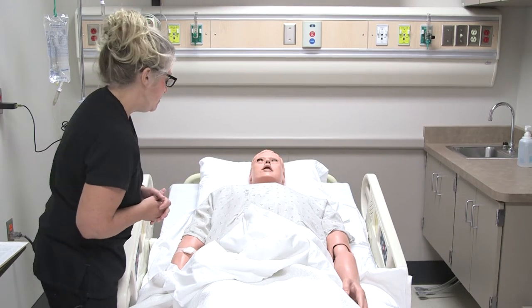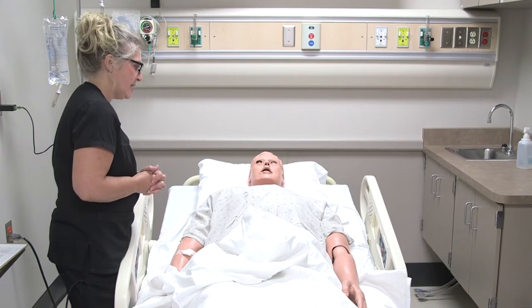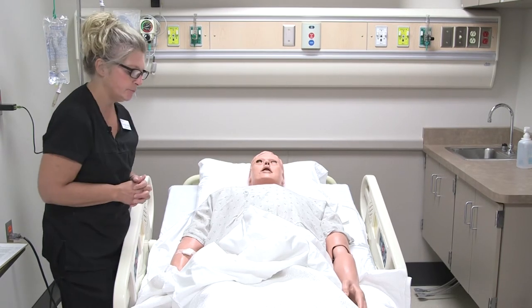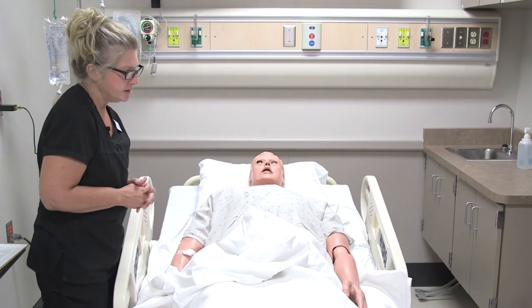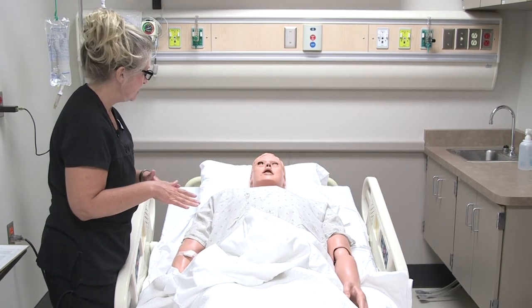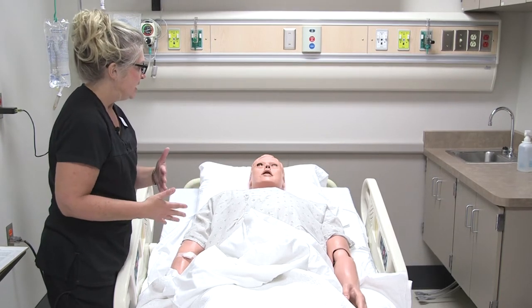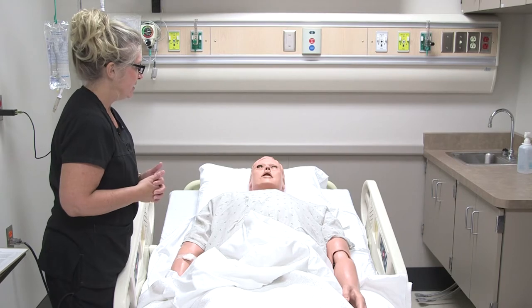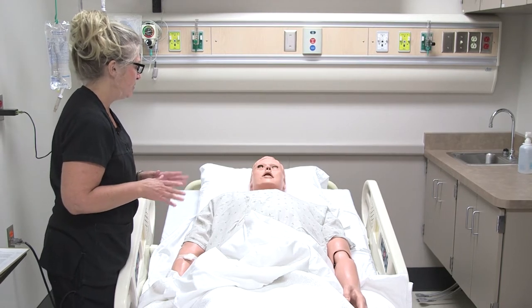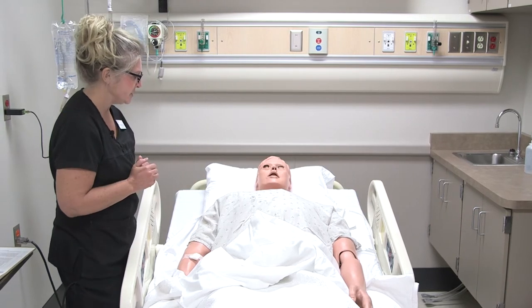All right. So at this point, do you have any questions for me right off the bat? Nope. Okay, great. Now, what I'm going to do first is we're just going to clean the area down there, just because we want it as clean as possible. Since we are putting a tube inside your body, we don't want any bacteria to get in there where it could cause some infection. So we want to make sure that we clean the area very good first.